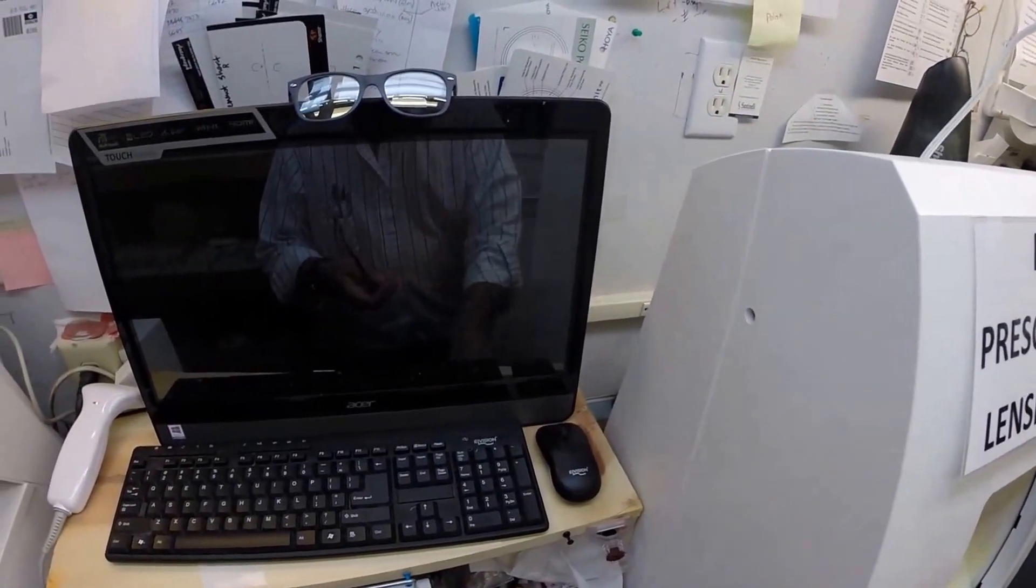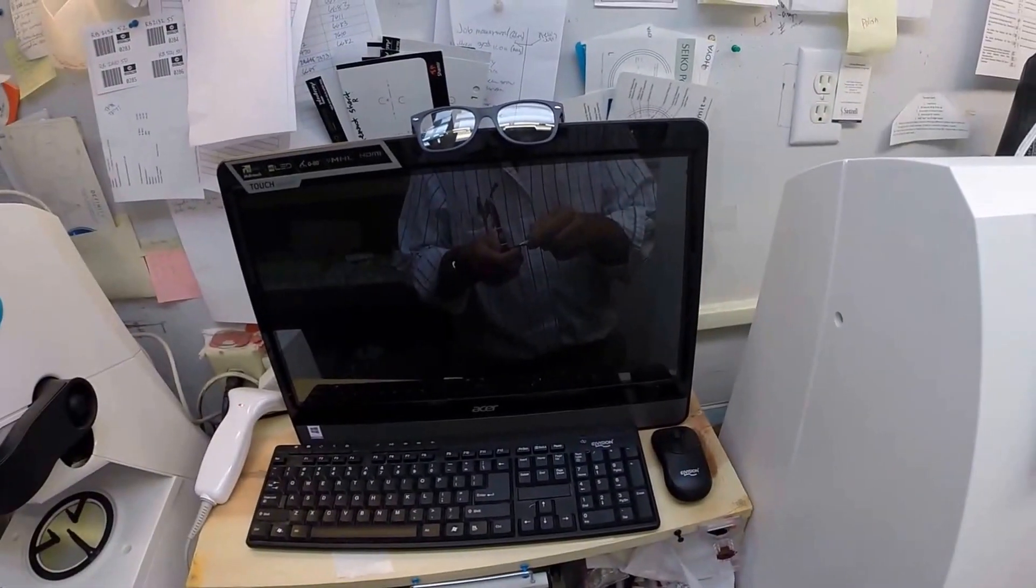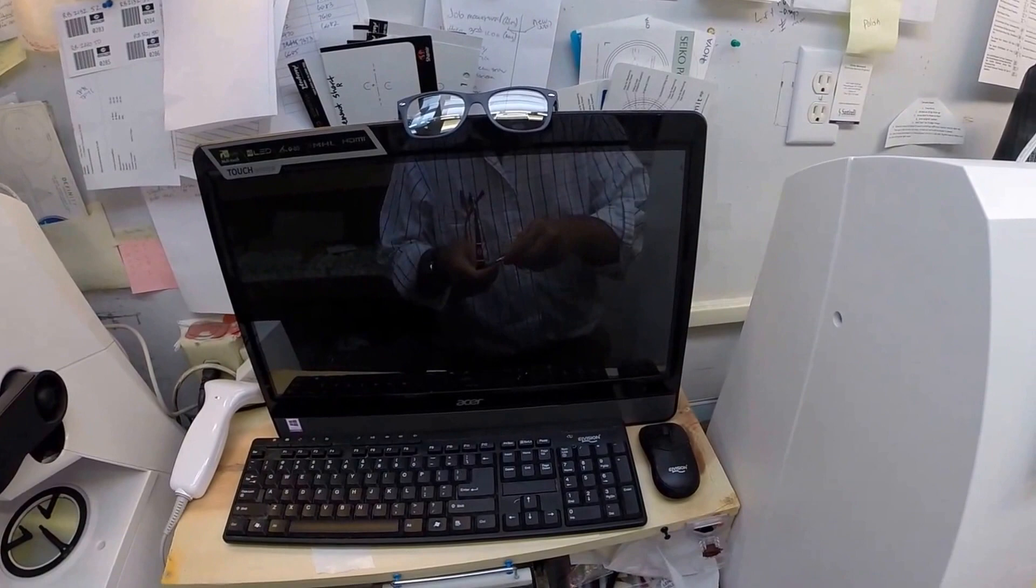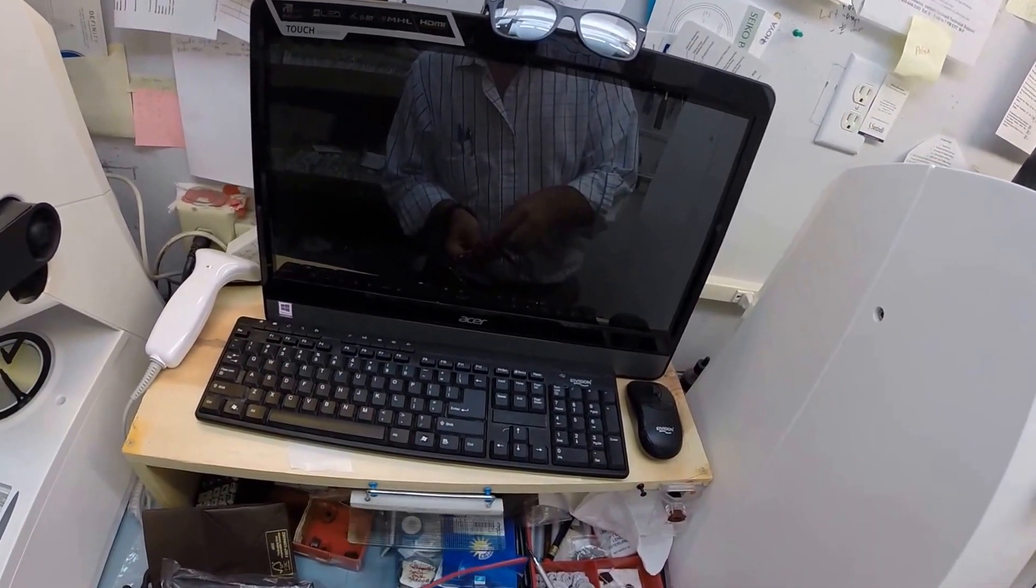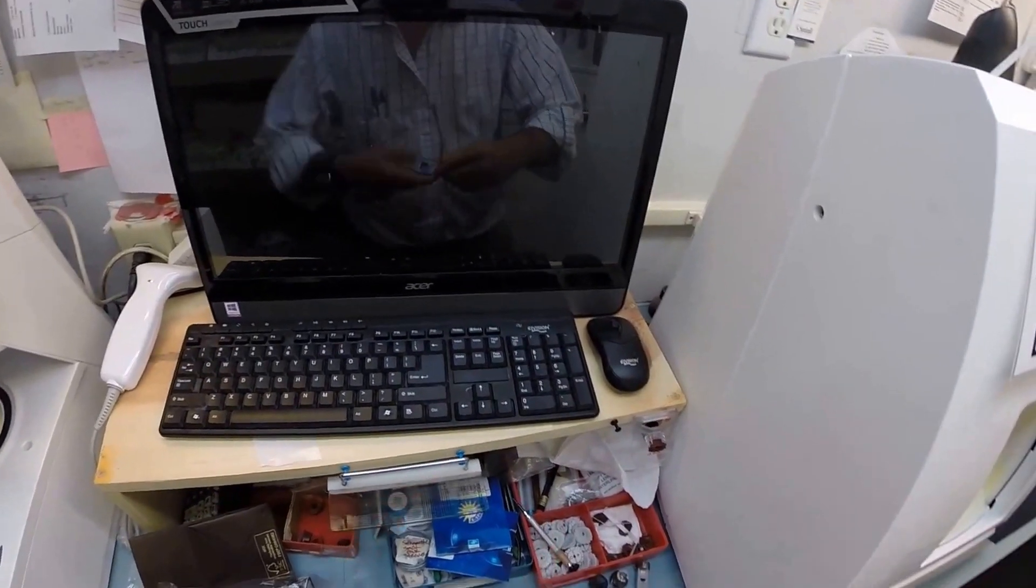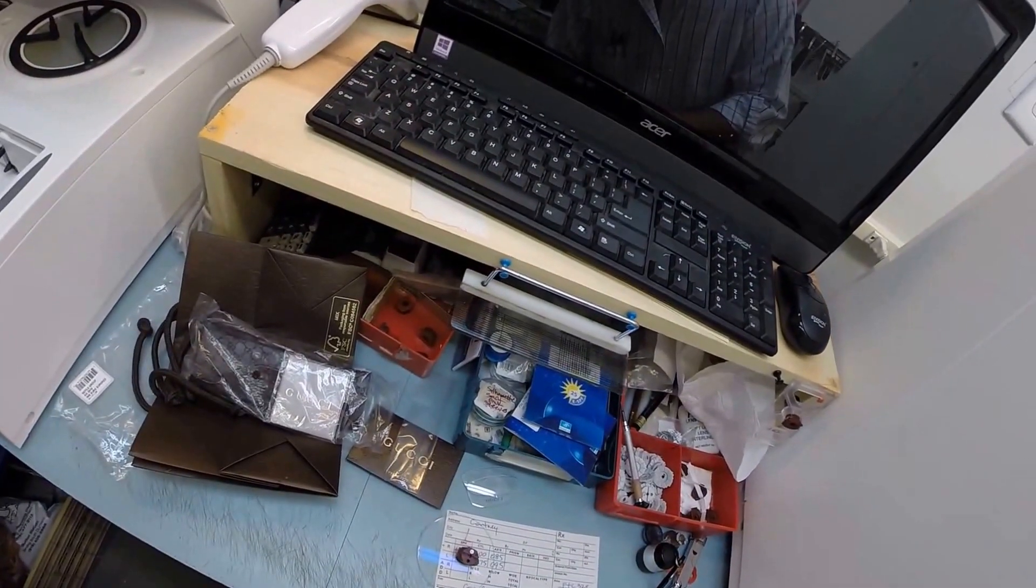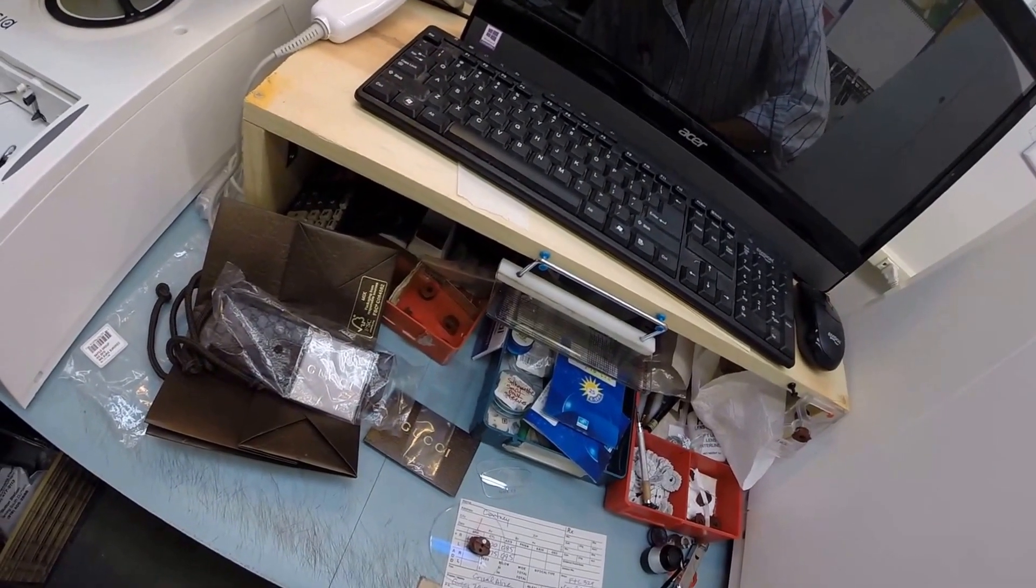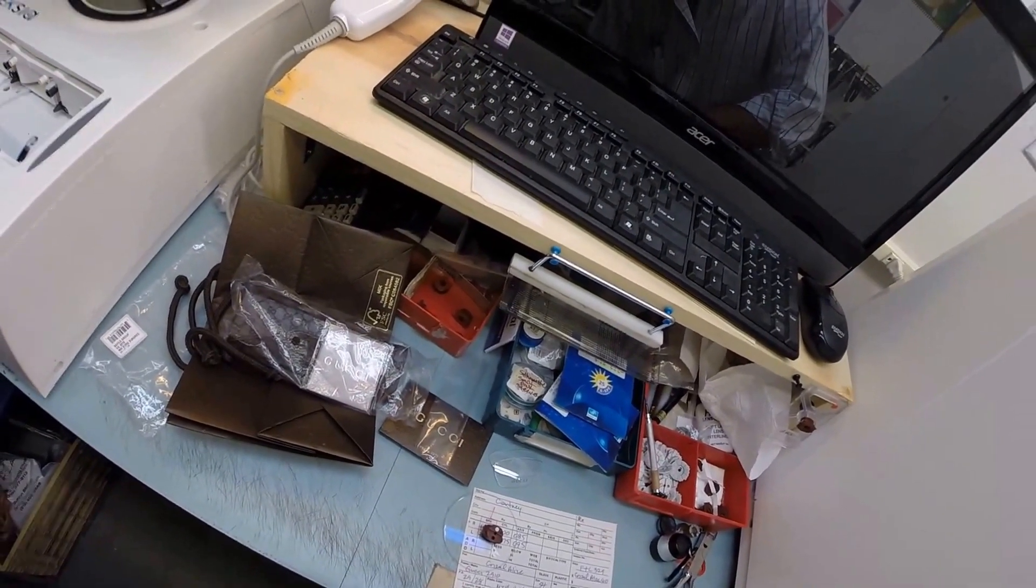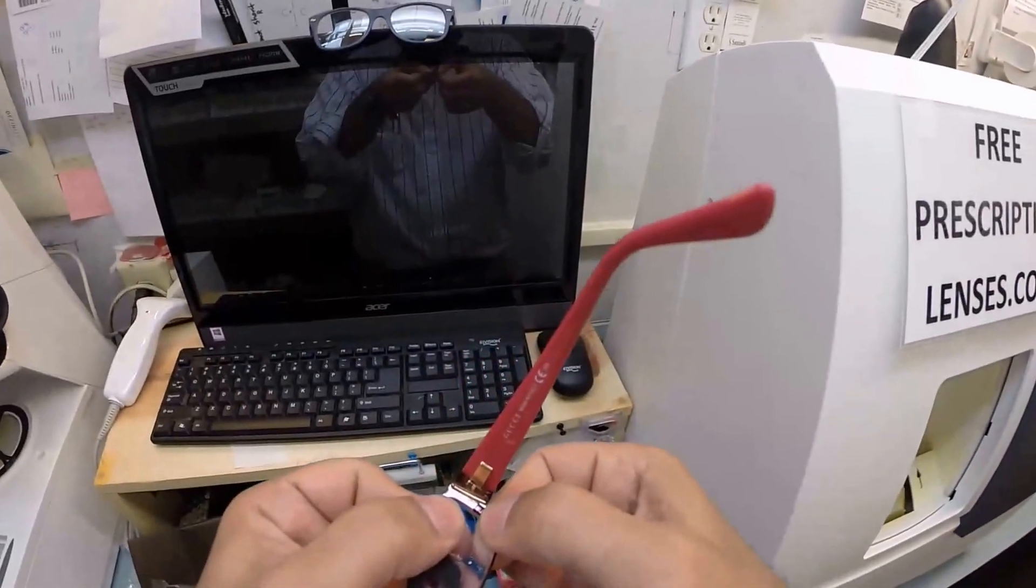I'm going to take my little Phillips head screwdriver, do the old lefty loosey, turn the frame around, tuck your lens in, and then a righty tighty. Hang on, hang on. I'm going to make sure everything is perfect. There we go. That's cinched up very nicely so we can go ahead and start cutting the left lens.